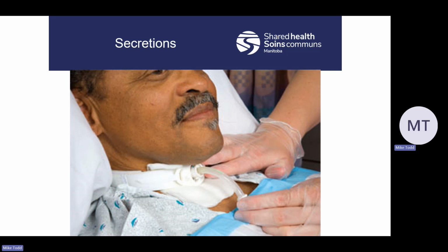So the easiest troubleshooting step is to remove and replace the inner cannula. Patients often have a supply at home that they're supposed to change daily. The worst case scenario is that if they're out of these tubes, we remove the inner cannula and just don't replace it. They still will be able to breathe with the tube in place. And like I said before, some of these can be washed. So if the patient is aware and has the proper solutions to clean them, we can assist them with that. We can take it out, clean it out, and then reinsert it for them.